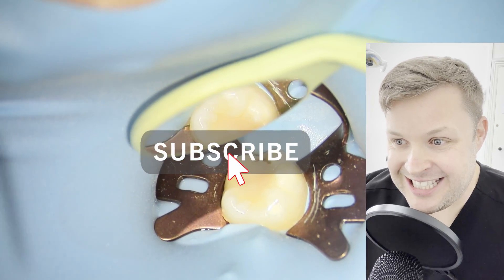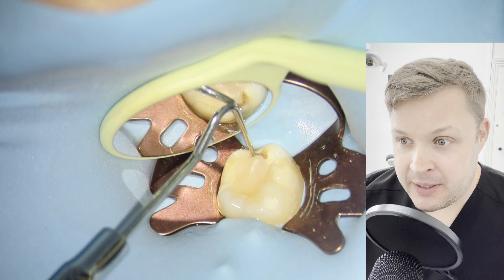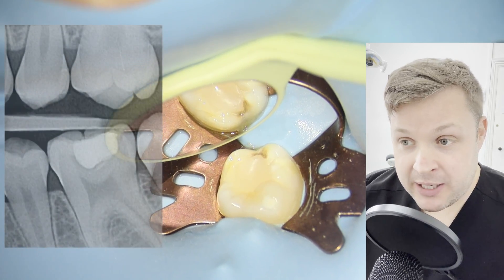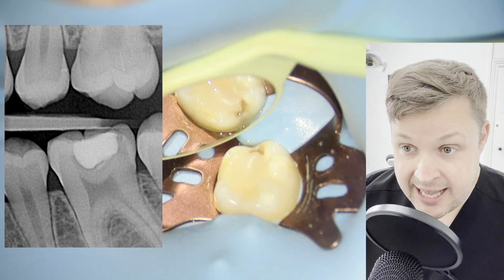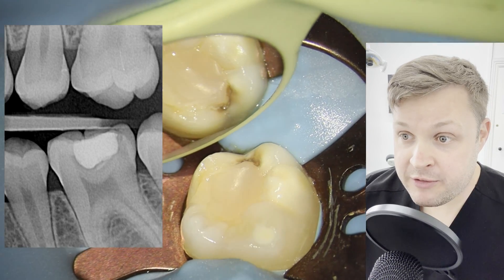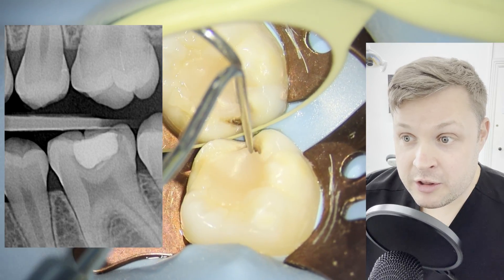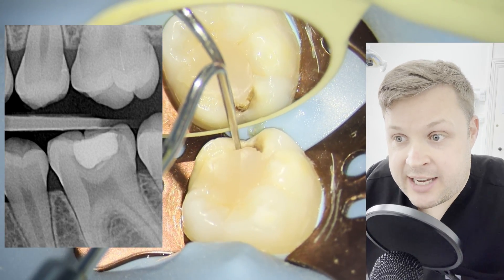Hello, welcome. This is a video about doing an indirect pulp cap. This was picked up on a routine x-ray and bite-wing radiographs taken at a routine examination. We found decay in the occlusal part of this lower six, and on the x-ray we can see there's a little bit of secondary decay underneath the filling itself.